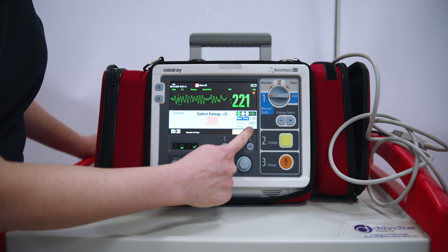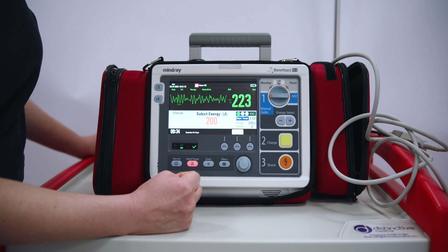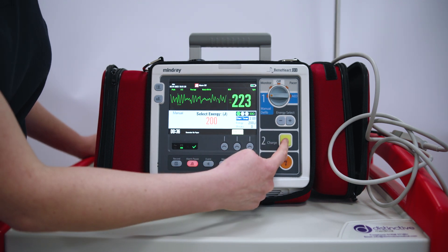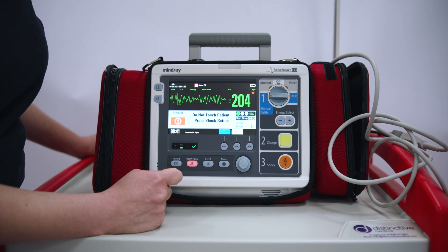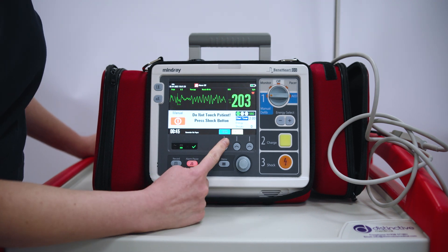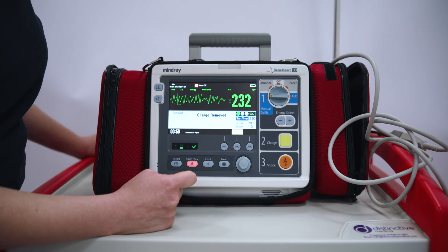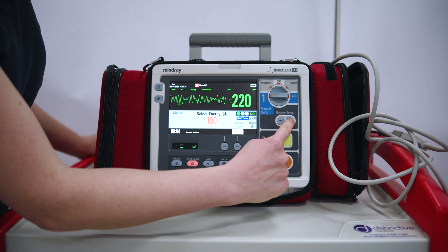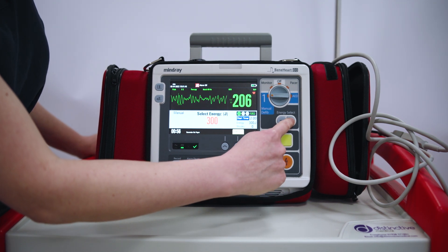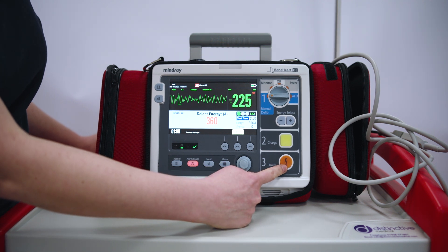This also tells us how many shocks we have given. To charge the defibrillator, I press charge. If for whatever reason it is an unsafe shock or environment, I can press the disarm button to remove the charge. If I want to change the energy, I can press the up and down keys. As I said, it will automatically escalate. Shocking is still the same — press the flashing button.